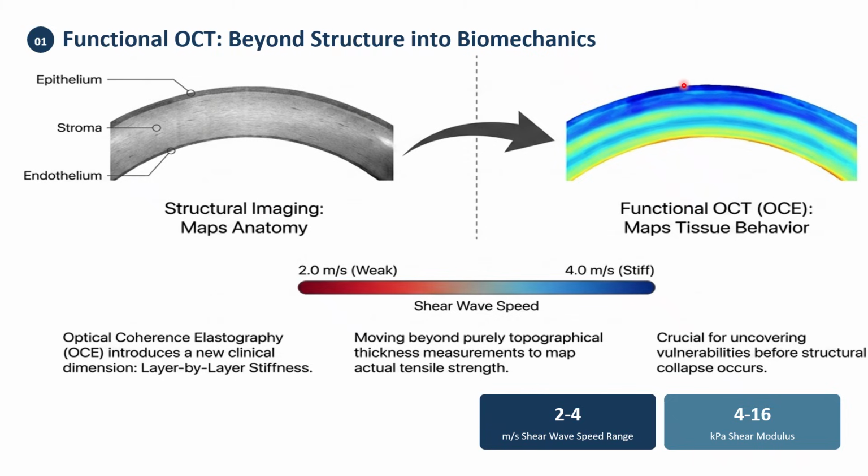So the most superficial part is the stiffest part of the cornea, and the deepest part is the least stiff part. So there is a steep gradient like this. This is very important in studying the function and biological property of the cornea.